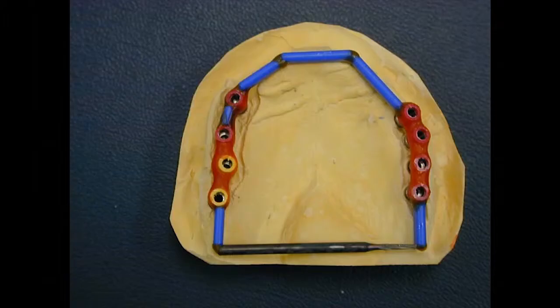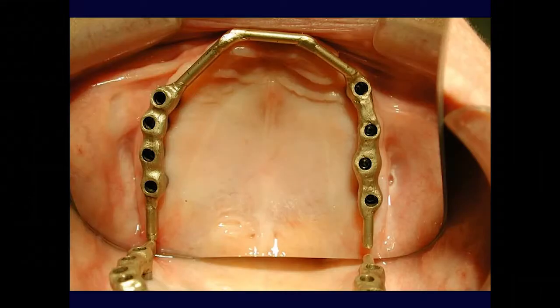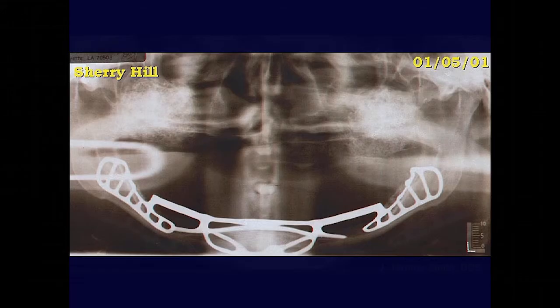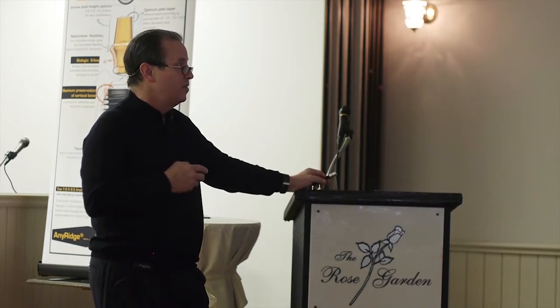This is a case that we did a long time ago where we've got a subperiosteal implant, I think. No, these are root form implants, Stereos in the maxilla. GC pattern resin, Dolder bars, cast up in gold, and with these clips, it's okay. I mean, to me, the locator is just so much better, all the way around. So, we did sinus lifts, some mandibular full subperiosteal implants. We don't do those anymore because they're a pain to do. And secondly, if you get any kind of strut exposure, it's a management nightmare. This case has worked out well, but it's too vulnerable to problems.